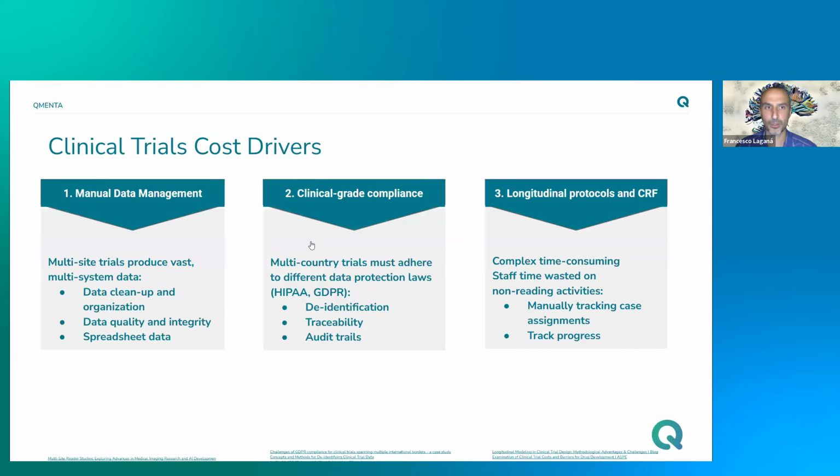But before we dive into the QMENTA Imaging Hub, let's take a quick look at the reality you're facing. If you manage clinical trials, you know they're not just expensive, they're very complex. Let's look at a few major factors that consume your budget and your team's energy.